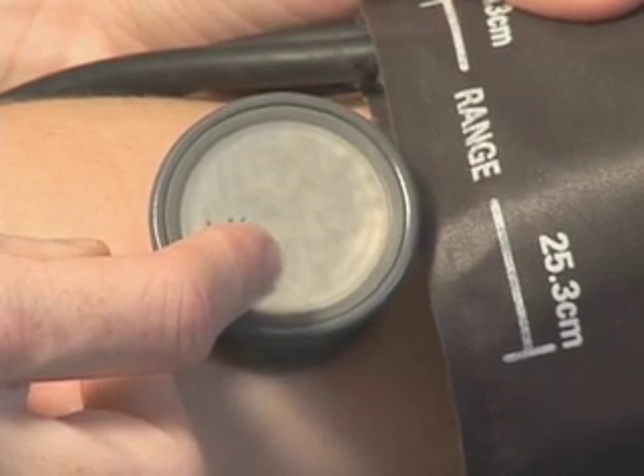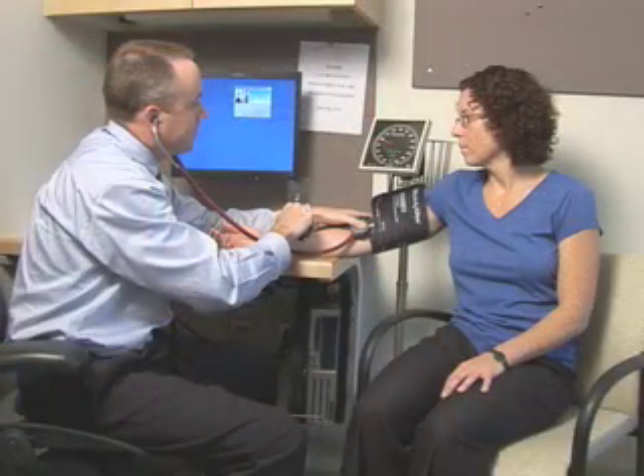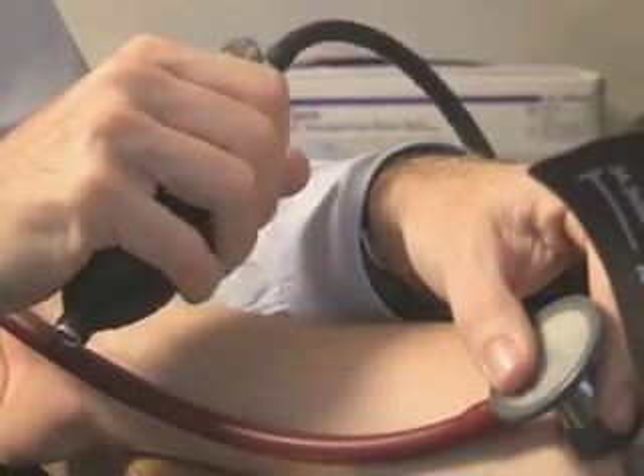Blood pressure is used in screening for hypertension and for monitoring the effectiveness of treatment in patients with established hypertension. In the routine outpatient setting, blood pressure is measured indirectly. Thus, it is important that proper techniques be used in order to produce consistent and reliable readings.